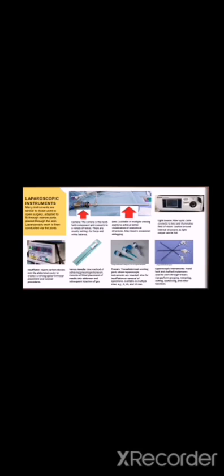And then there is the Veress needle. One method of achieving a pneumoperitoneum consists of blind placement of a needle into the abdomen and subsequent injection of gas. Trocars, transabdominal working ports where laparoscopic instruments are inserted, are also used for insufflation or removal of specimens. Available in multiple sizes, for example 10, 5, and 12 mm. Laparoscopic instruments, hand-held and shafted implements used to work through trocars, can perform grasping, retracting, cutting, cauterizing, and other functions.